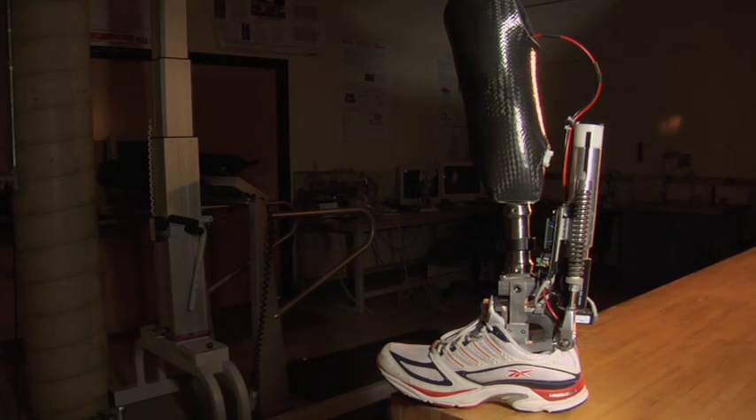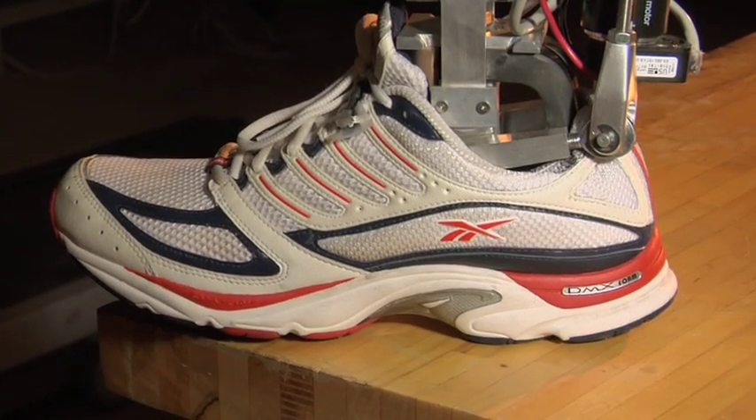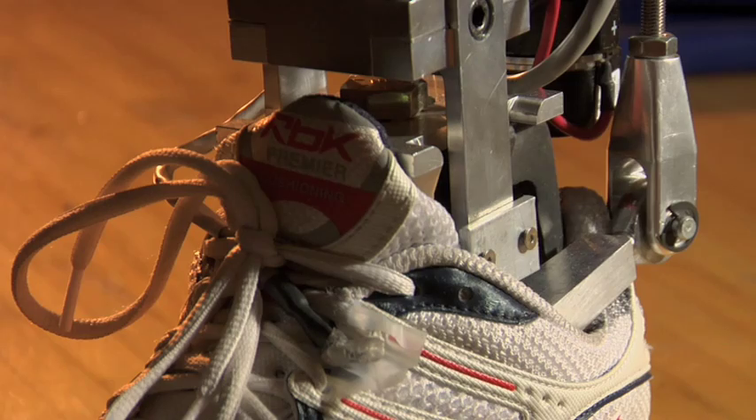There are unique positions of your leg and also a unique position of your foot. By measuring where your leg is, it knows exactly where your foot should be. By doing some clever things with the math in between, you can make it work on stairs and slopes.